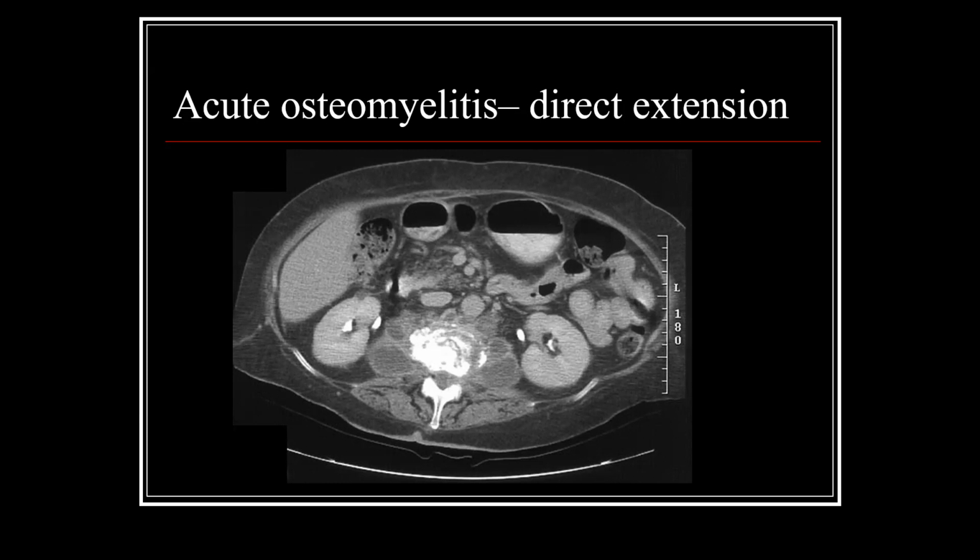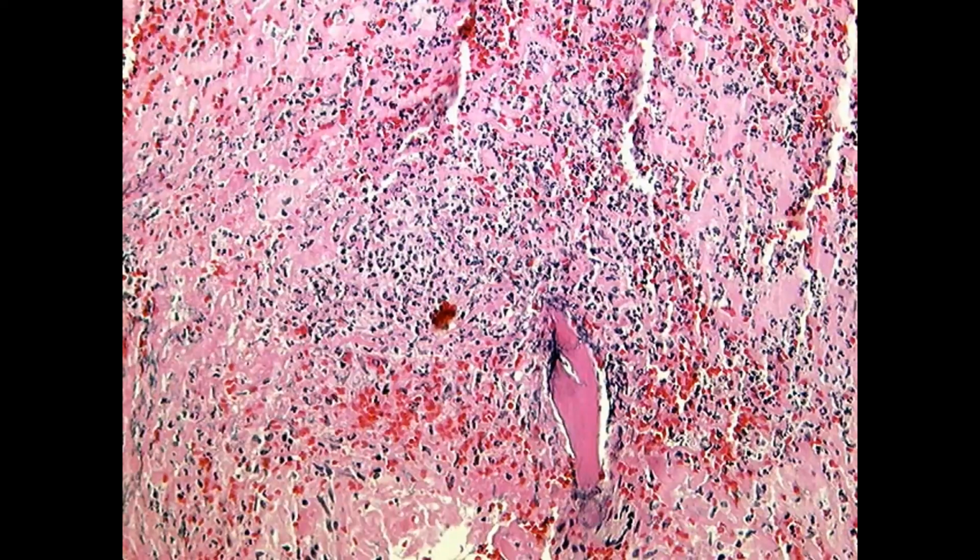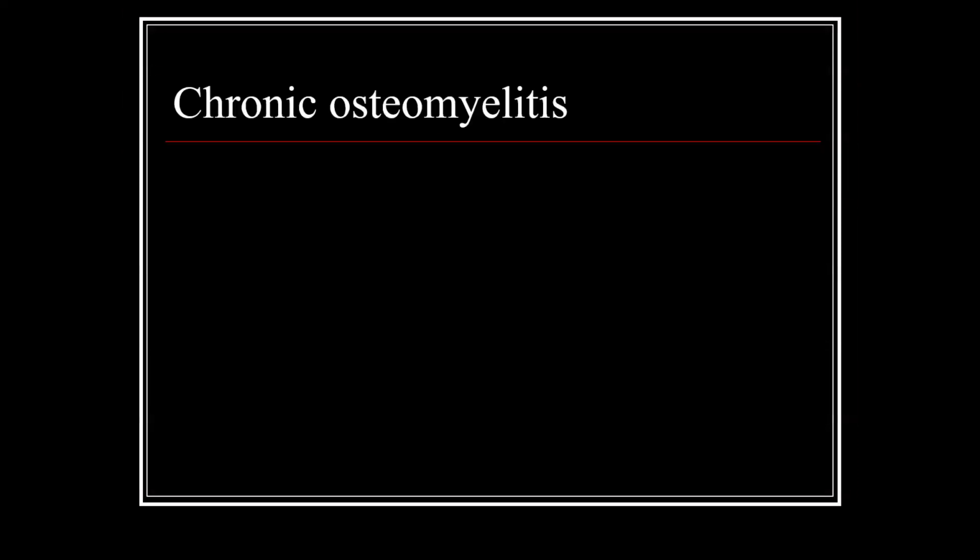Anyway, you can see that you get a mixture of lysis as well as osteoblastic phenomenon here in this secondary involvement here from nodes adjacent to that. For osteomyelitis, we like to see bony necrosis and destruction, and then, of course, the associated fibrin, inflammatory cells, and so forth. You may be able to demonstrate organisms with specific stains, but it's a little bit difficult, as we know, to precisely define those with bug stains, particularly after you've had to decalcify a specimen.